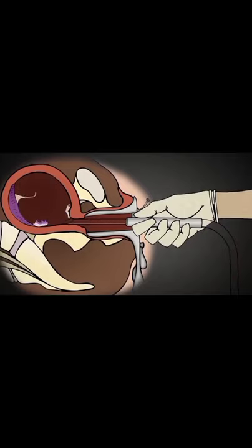Down the suction tube, into the syringe or vacuum machine. Following the baby, the placenta is sucked out.